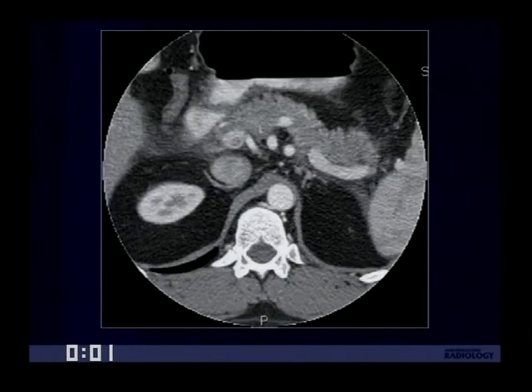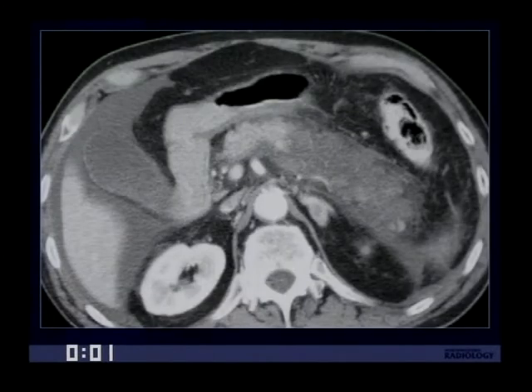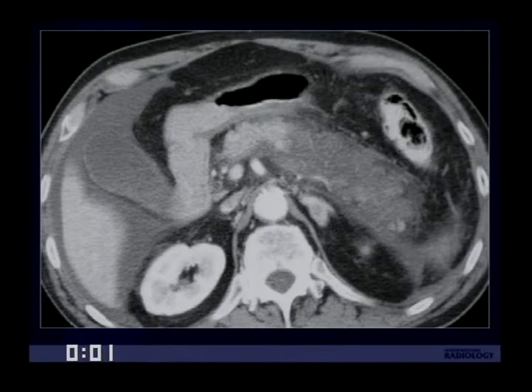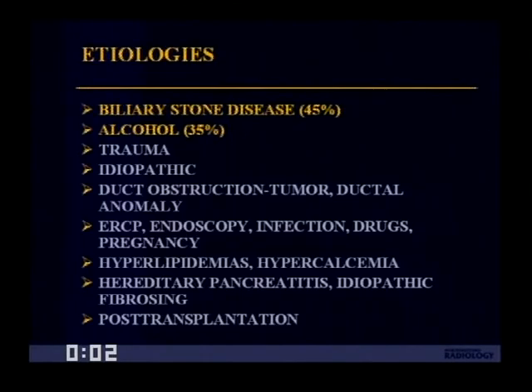Here's an example of a patient with mild acute pancreatitis where you can see the pancreas size is normal to mildly enlarged, but notice the presence of interstitial edema and surrounding peripancreatic inflammation and fluid. Another patient has a more severe form of pancreatitis — this is a patient with pancreatic necrosis involving the body and tail of the pancreas. The etiologies of acute pancreatitis in the United States are most commonly due to biliary stone disease in women and alcohol, especially in men.